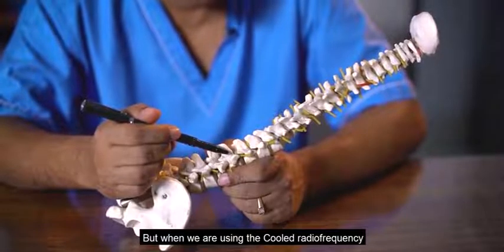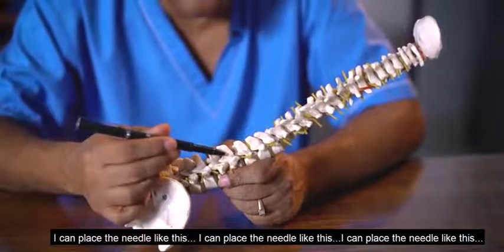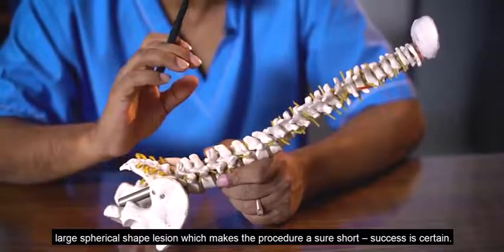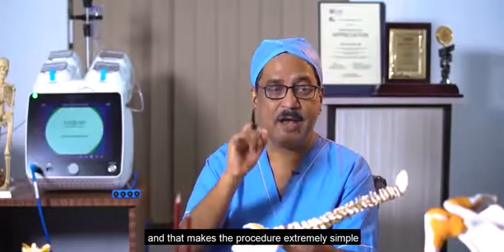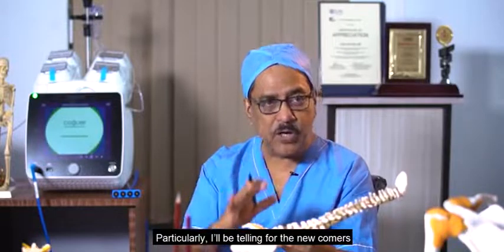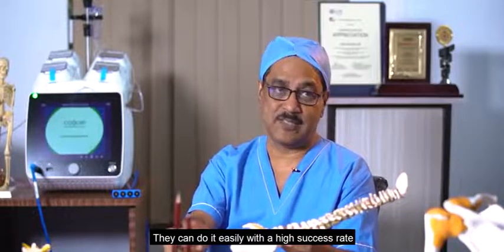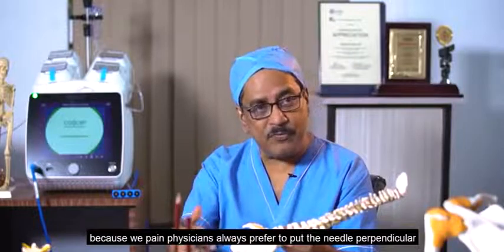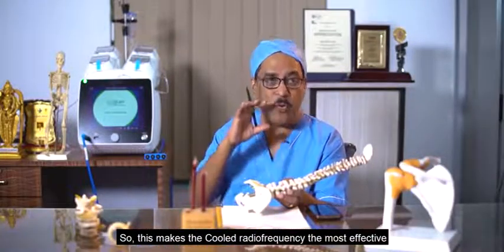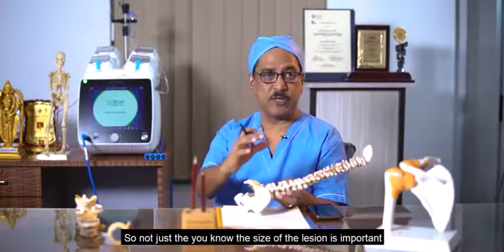But when we are using Kool Darif, my needle can be placed at any angle. I can place the needle like this, or like this, or like this — because it is going to produce a large spherical lesion which makes the procedure a sure shot. Success is certain, and that makes the procedure extremely simple. Particularly for newcomers who are not well versed with radiofrequency techniques, they can do it easily with a high success rate, because pain physicians can place the needle perpendicular, which makes the technique easier.